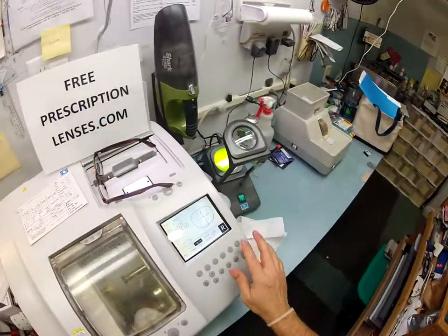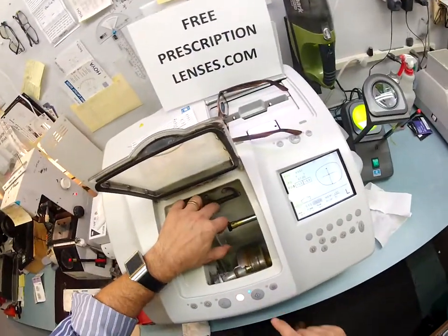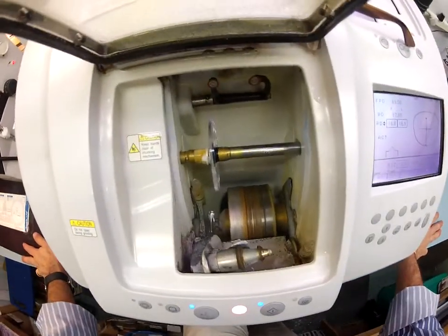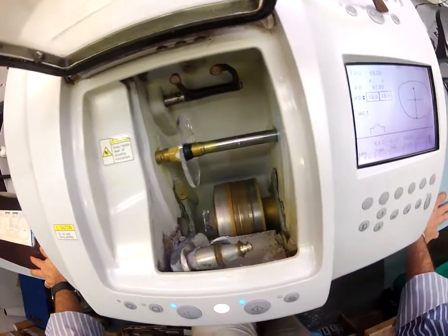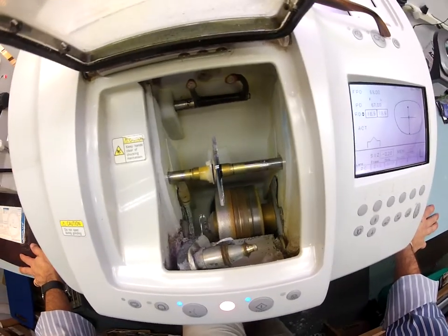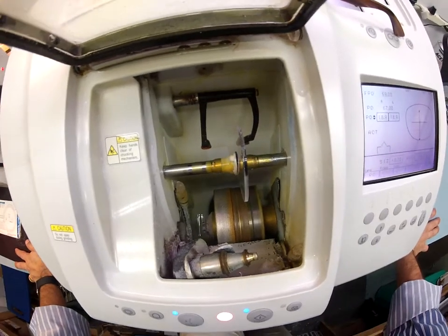So let's cut the left lens. Flip that over to the left and hit start. Just like before, the calipers are going to come down and trace the shape of your left lens onto this lens to make sure it's large enough to cut out. And it is. There's no way I can override this, but people like to watch this.